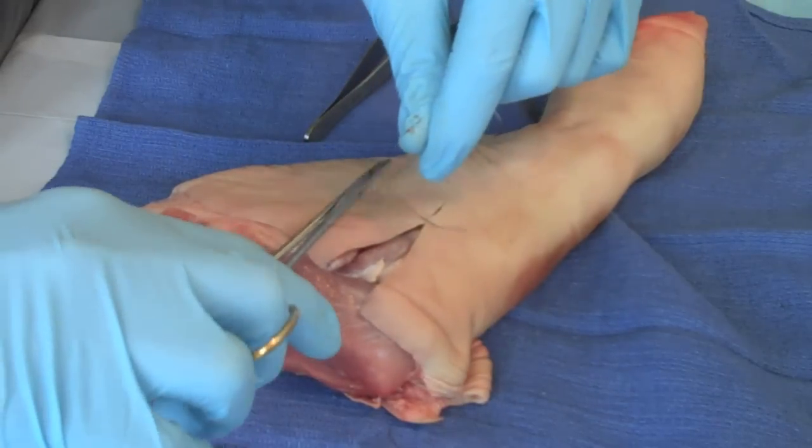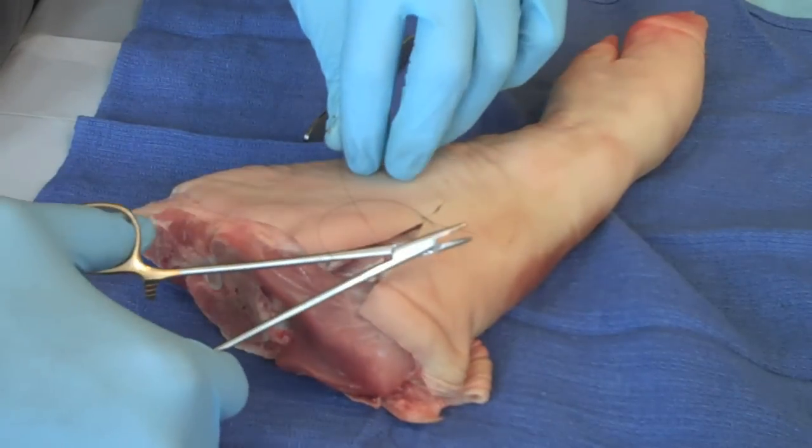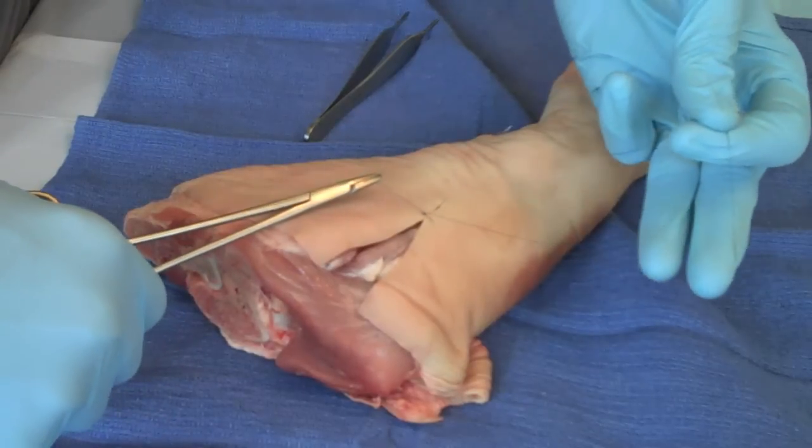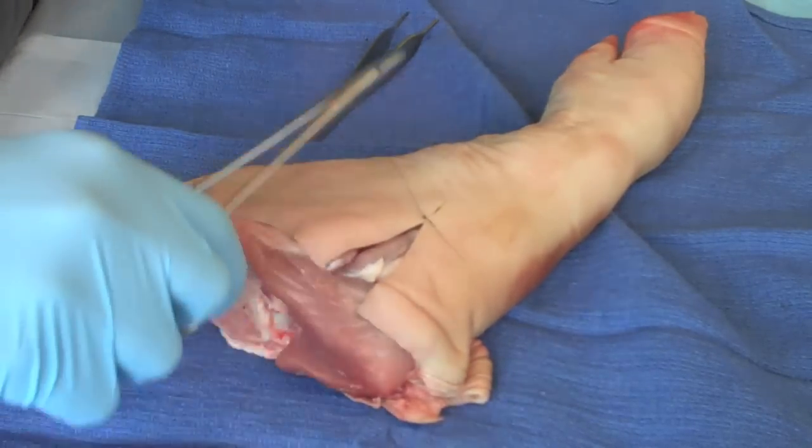You'll note how when I throw a suture, I don't pull it too tightly across. Many people make that mistake in their first stages of this — they will tend to want to do too much.